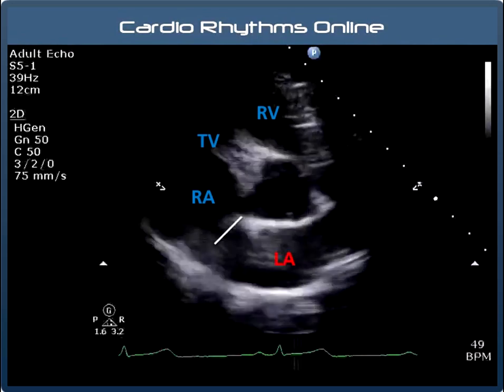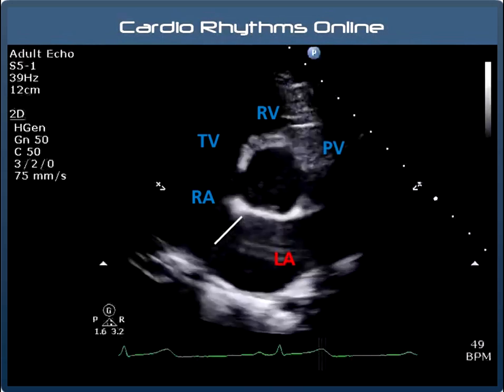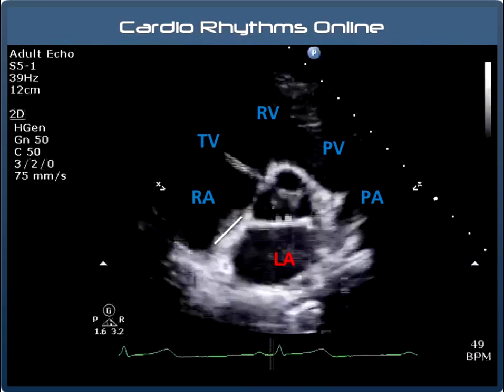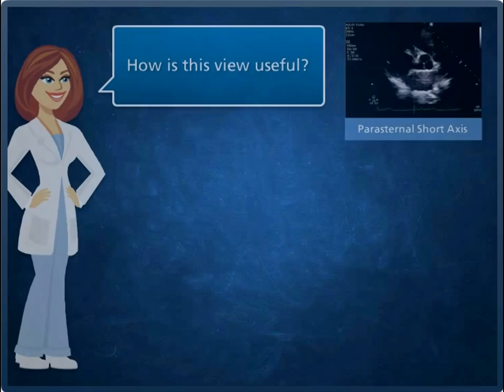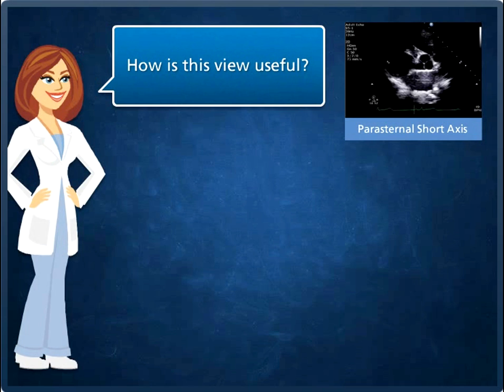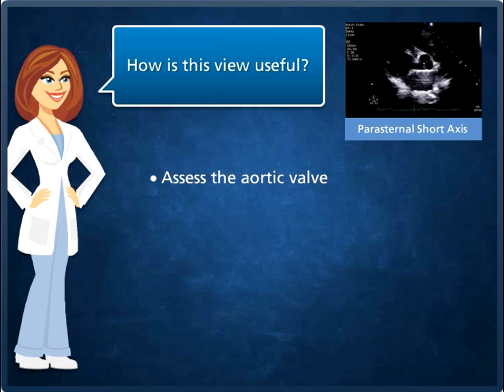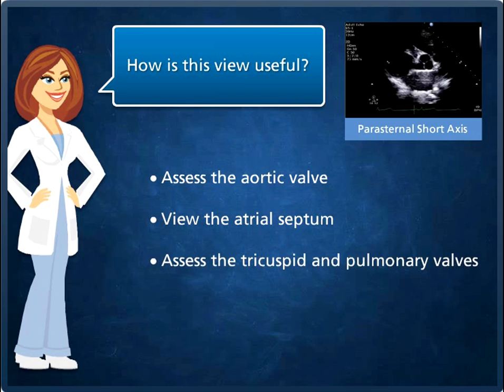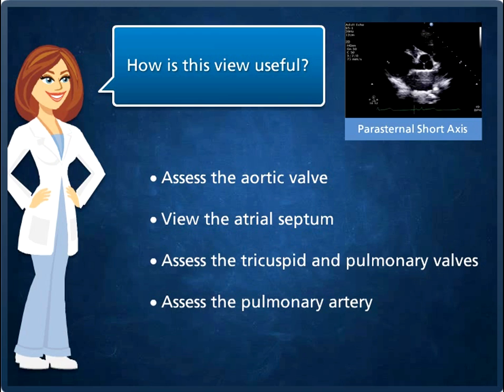Angling up a bit further, we would then also be able to view the pulmonary valve and the pulmonary artery more clearly — this will give you a rough idea of where you'll see those structures. We mainly use this view to assess the structure of the aortic valve, checking that it has three cusps. This is also a good view for visualising certain types of ventricular septal defects. Sometimes this view gives us a really good look at the atrial septum, so we can check for things like aneurysms or atrial septal defects, assess the tricuspid and pulmonary valves, and also assess the main pulmonary artery. We can check for abnormalities such as a patent ductus arteriosus, but more about some of these defects in another screencast when we start looking at colour flow Doppler.